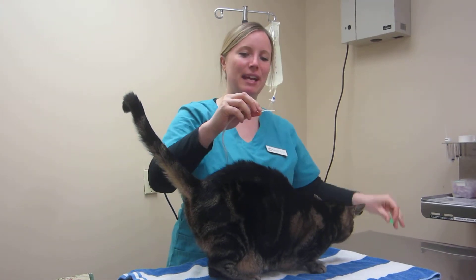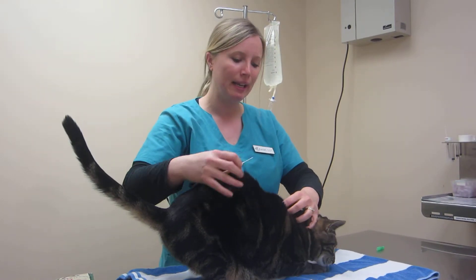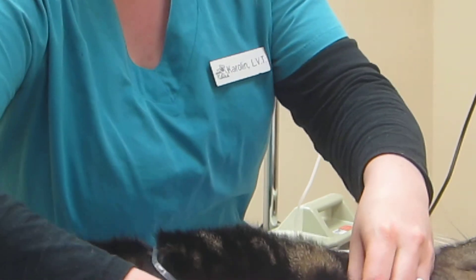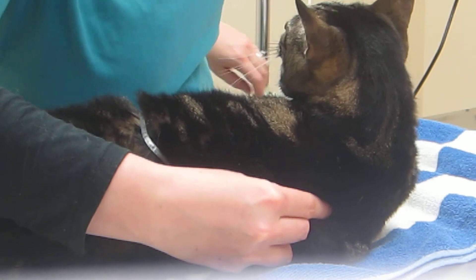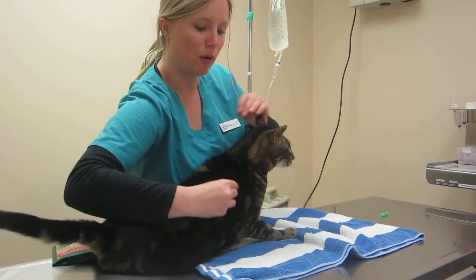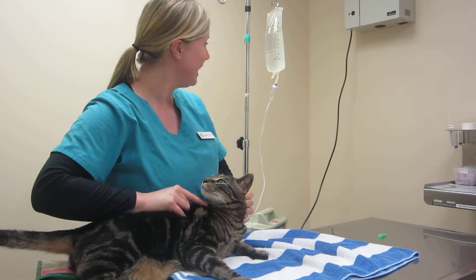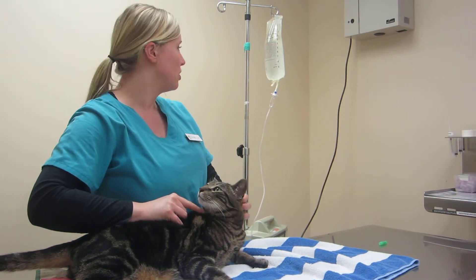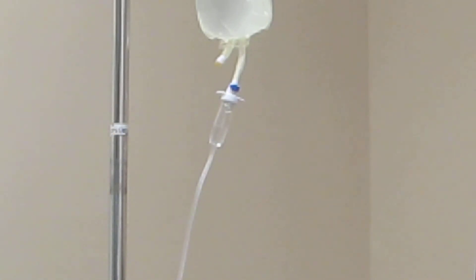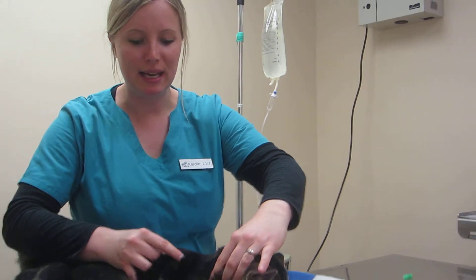When you're ready to start, you want to take off your cap. Make sure that needle stays nice and clean because it is the end of your line. You're going to pull up the skin like a tent and go through the skin — that's the part that most cats feel a little bit, so you want to be quick about it. Right away, I'm going to keep my hand on here while he's being silly, and go ahead and look at your drip chamber. You can see it's flowing really nicely, and I don't have any leakage — that means it's in the right place.